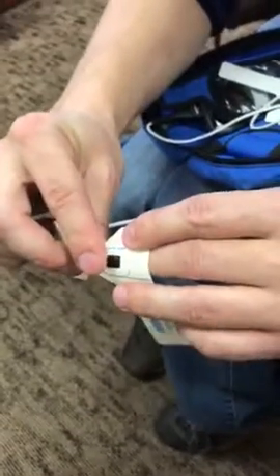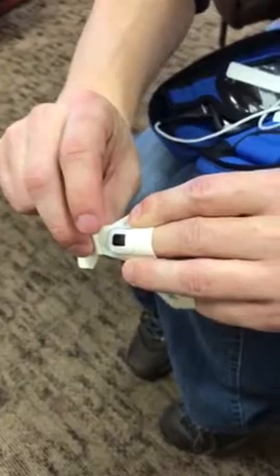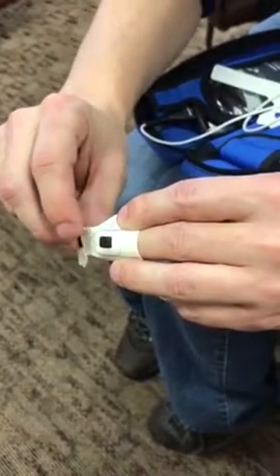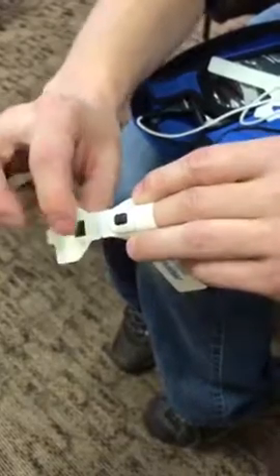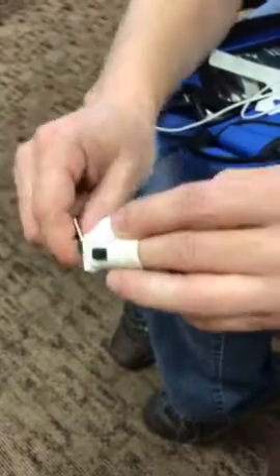Put it right on your fingernail — it can go on either three of these fingers on either hand. You can see the blue finger right there. Make sure that's there; there's no blue finger on the other side, so if you don't see that, you're doing it incorrectly.